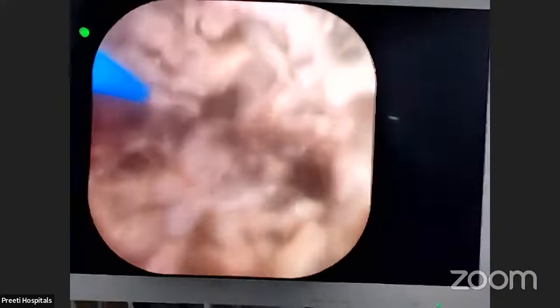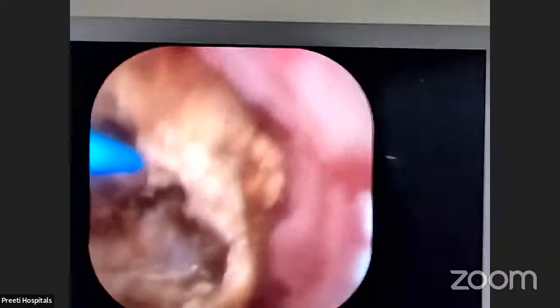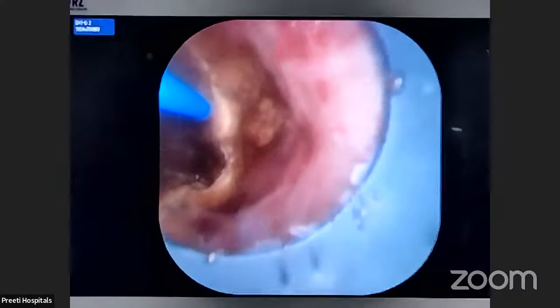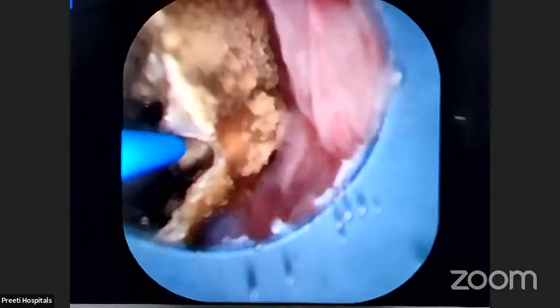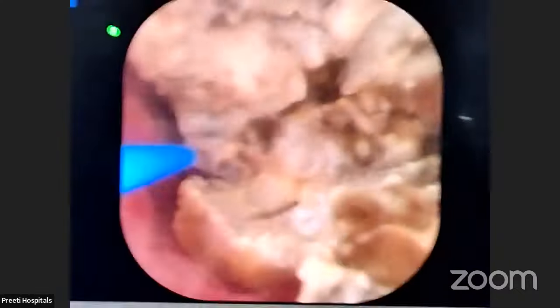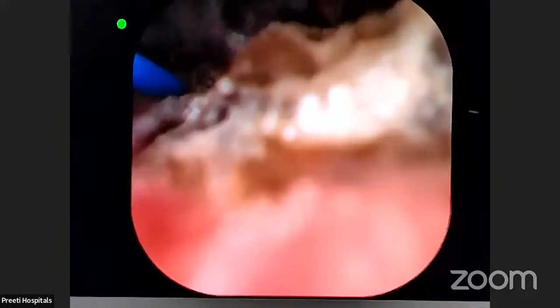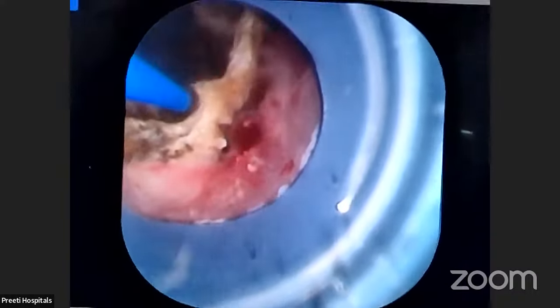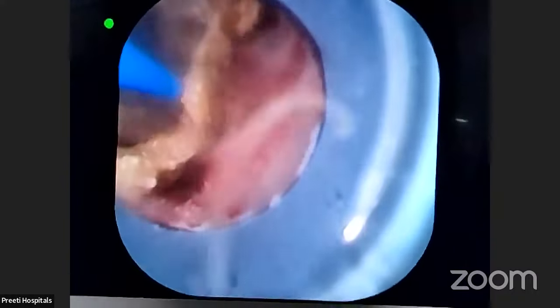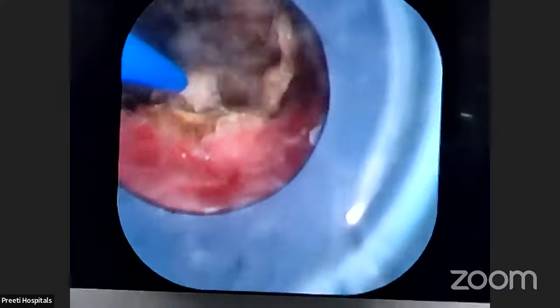See, completely we can show today the entire kidney. His exchange is very fast. Ramakrishna is very senior and his exchange is very, very fast. If you don't exchange well and if you start sucking, bleeding will come. Now, till now, we have not seen bleeding. See how big stone it is. And this stone for PCNL is a stone-guided puncture, upper pole. No problem, but dilatation will be difficult. See how I am keeping the mouth of it. The access sheath is just at the mouth of it. Why is not all this powder coming out? I hope everybody is observing.